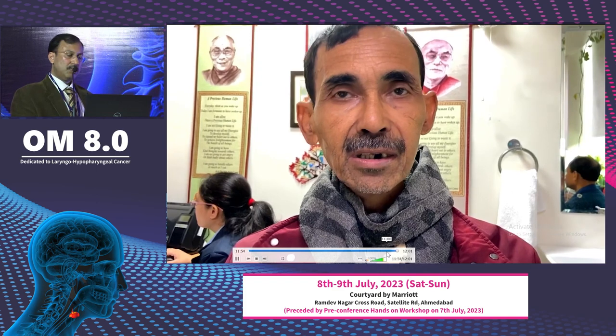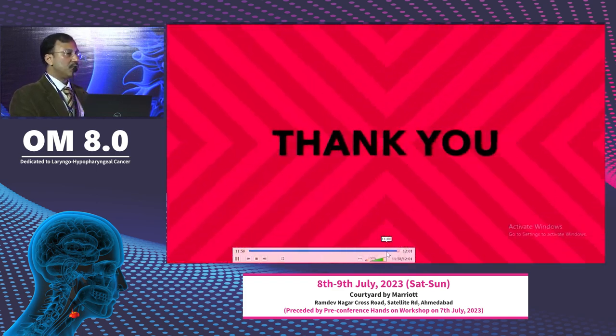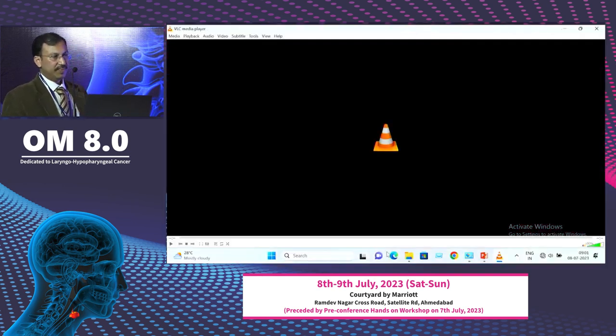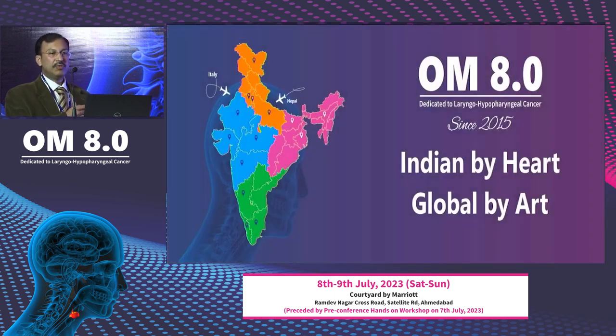So these are rare cases we do. Once in a while we get. But the challenge is there in exposure. That's what I say. So one has to be mentally prepared when you're doing these kind of cases that you might have to open up. So this is what, and for the carotid, while doing a neck dissection, you have to cover the carotid also using a PMF. In this, we had used a PMF to cover the carotid to prevent the fistula.